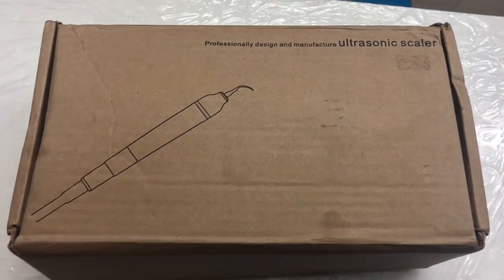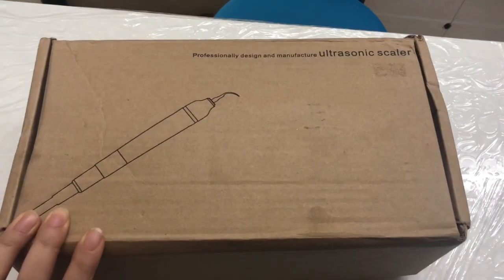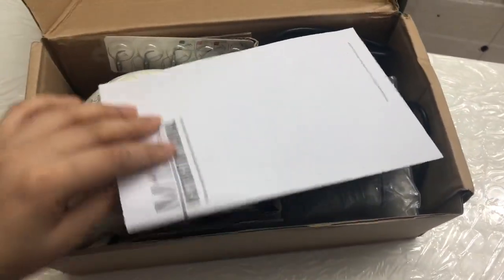Hello friends, back again with this new product. This is a Crosonic Scalar Machine which I just recently bought from Nexus Mega Man in England. So let's unbox this and let you know what is inside this box.